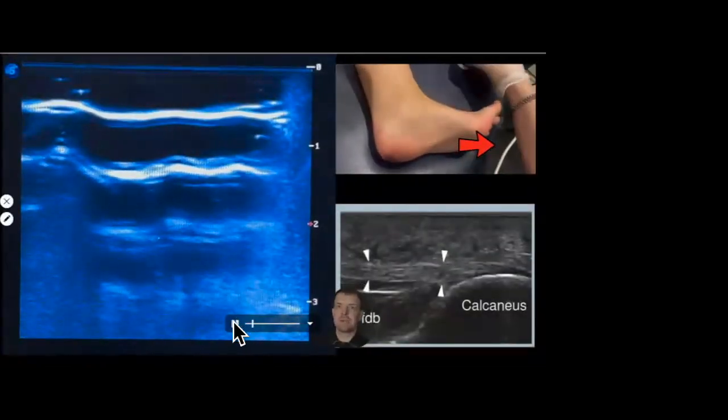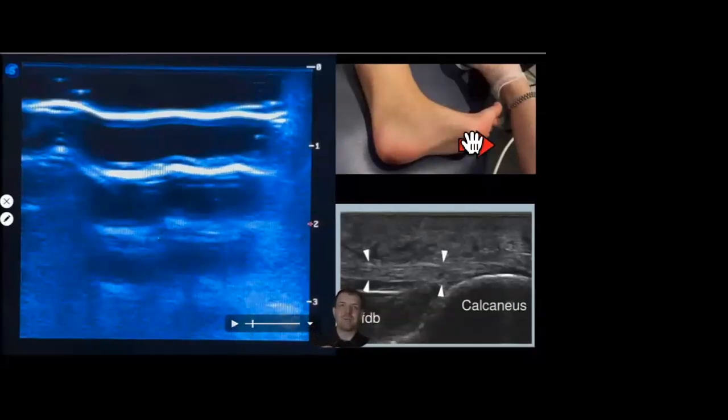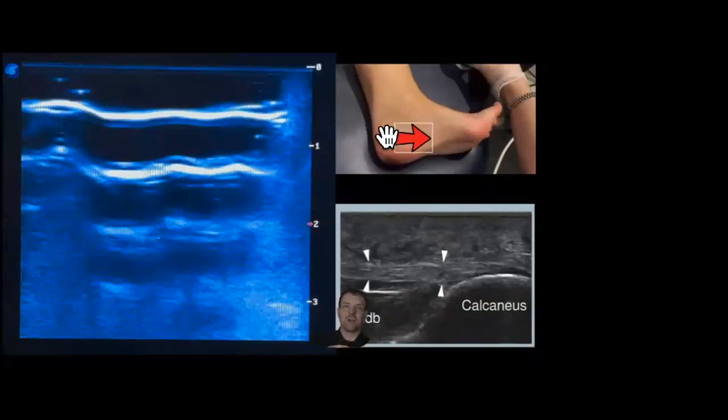So it's recommended that you look at the plantar fascia in the same position as the Achilles, but I couldn't get the video and do that at the same time. So what I did was I just got my daughter lying on her side, and got her to dorsiflex the foot, but I mean, you can see the plantar fascia there. So what you want to do is palpate the medial aspect of the calcaneus where the plantar fascia attaches. You can feel the calcaneus, and then you can see the plantar fascia.